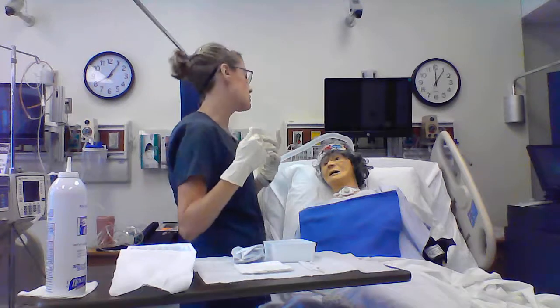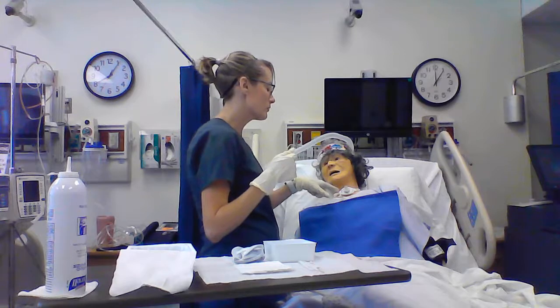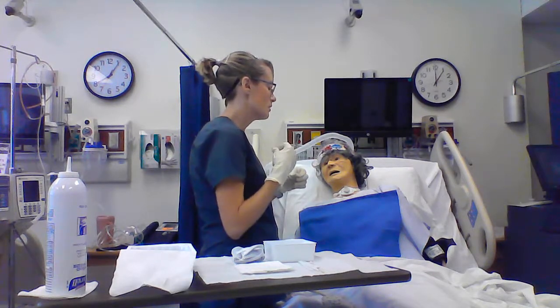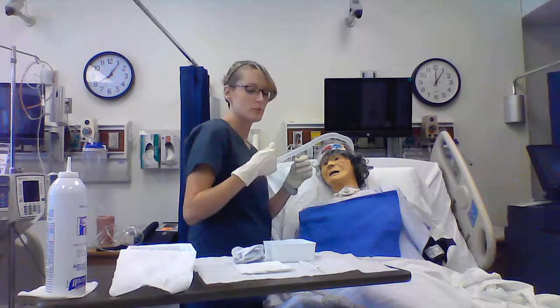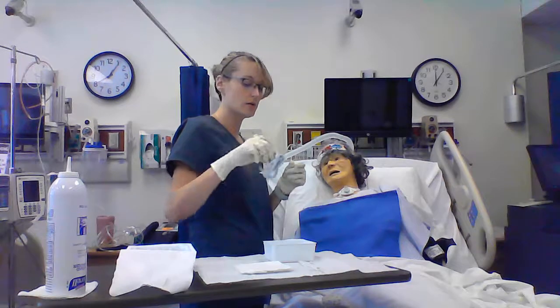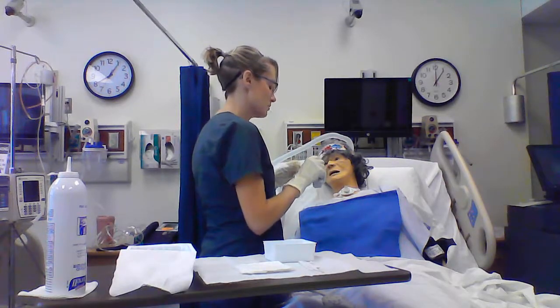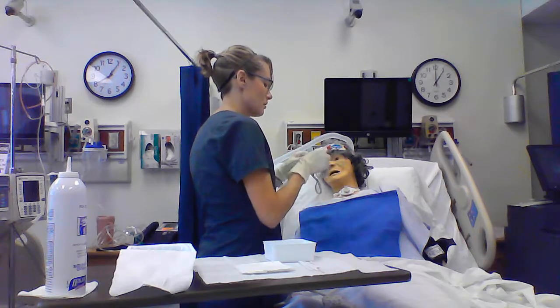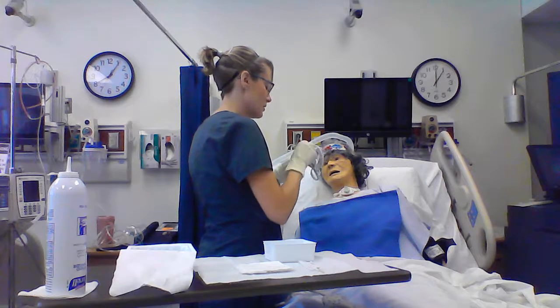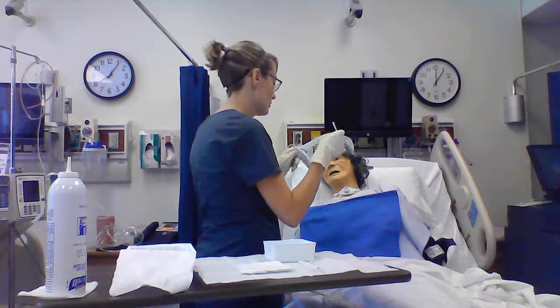And then I'm going to get ready to change out her trach ties. So if I had an assistant, I would have them hold this phalange in place so that it doesn't move or adjust as I loosen the ties up and put new ones on. I don't have an assistant, but she's pretty alert and oriented, so I'm going to let her lift her head for me and stay as sterile as I possibly can as I do this for her. So I'm going to have Miss Opal lift her head up for me so that I can get the new ties behind her head.